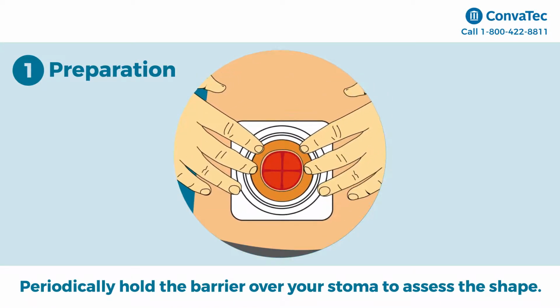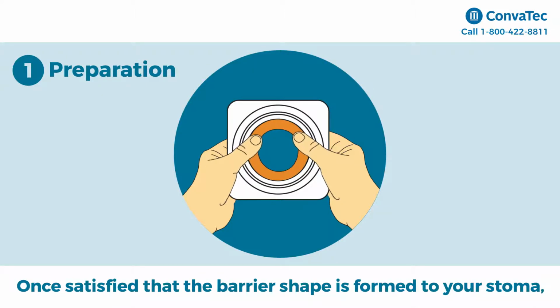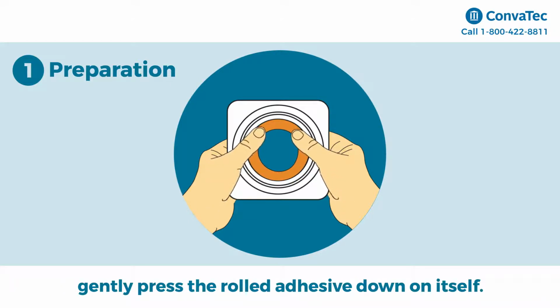Periodically hold the skin barrier over your stoma to assess the shape through the clear release liner window. Once you are satisfied that the shape of the skin barrier opening is formed similar to your stoma, gently press the rolled adhesive down on itself.